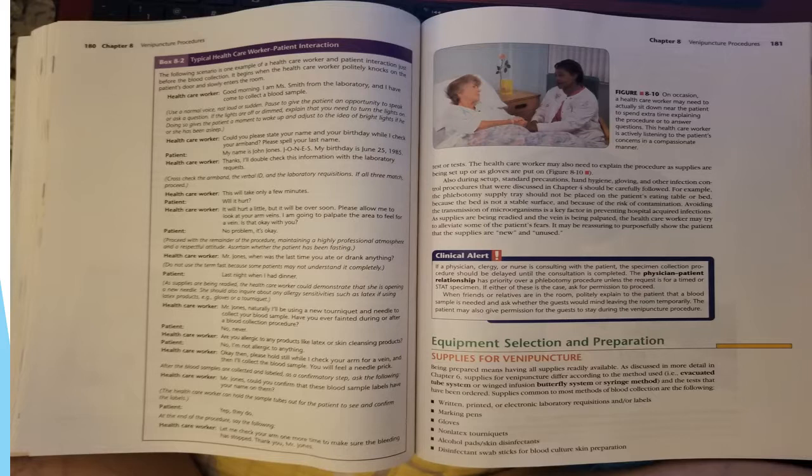Equipment selection and preparation. Supplies for venipuncture. Being prepared means having all supplies readily available. As discussed in more detail in Chapter 6, supplies for venipuncture differ according to the method used, i.e., evacuated tube system or winged infusion butterfly system or syringe method, and the tests that have been ordered.